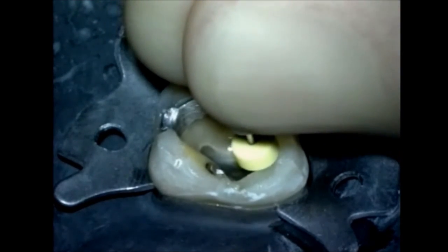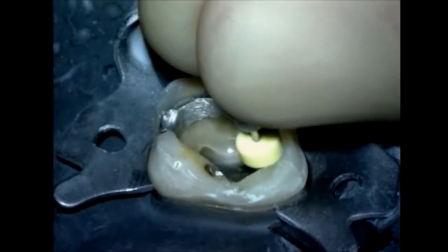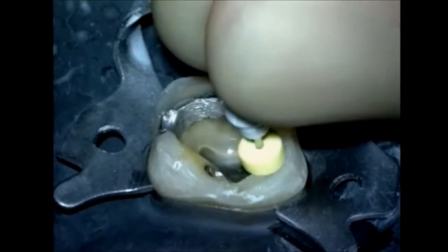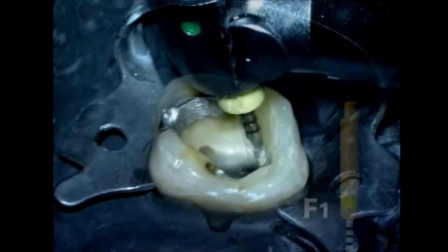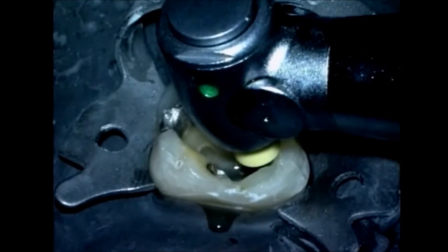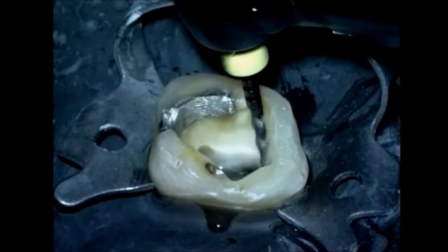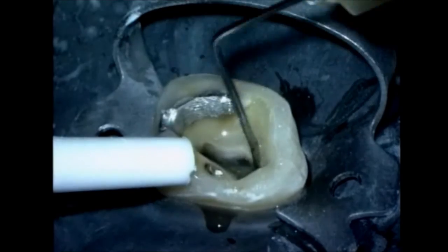Now we reconfirm the glide path, and this is accomplished by taking progressively longer strokes. When we have a smooth and reproducible glide path, we're ready to proceed to Finisher number 1, which has the yellow identification ring on its handle. This instrument is allowed to move easily into the canal and floated to length. Generally, it will achieve length on the first pass. When we've achieved length, the instrument is immediately withdrawn. Now we can irrigate, recapitulate, and re-irrigate.